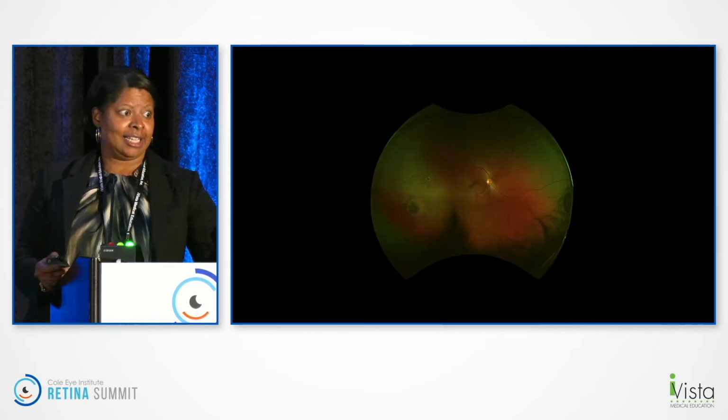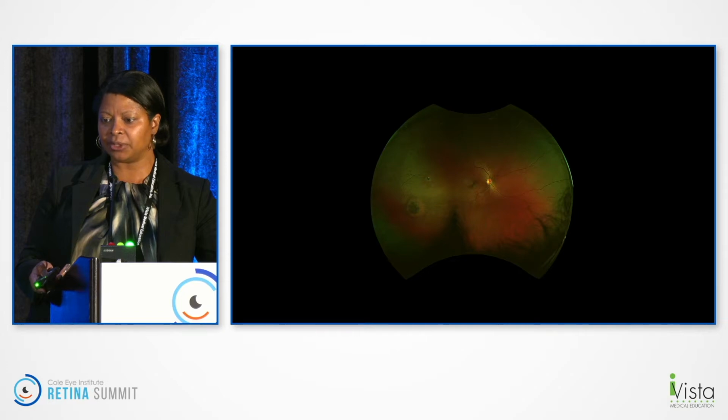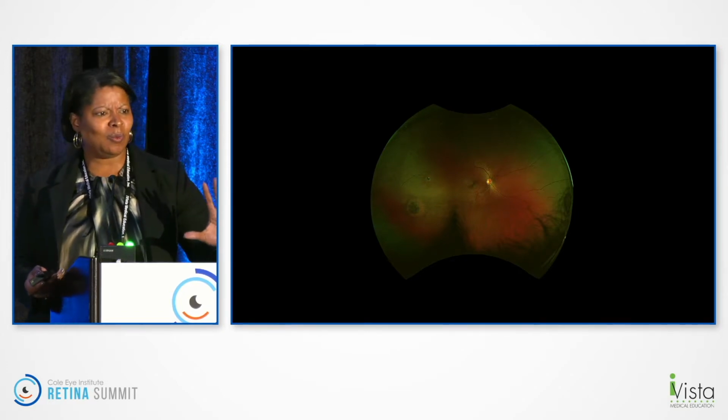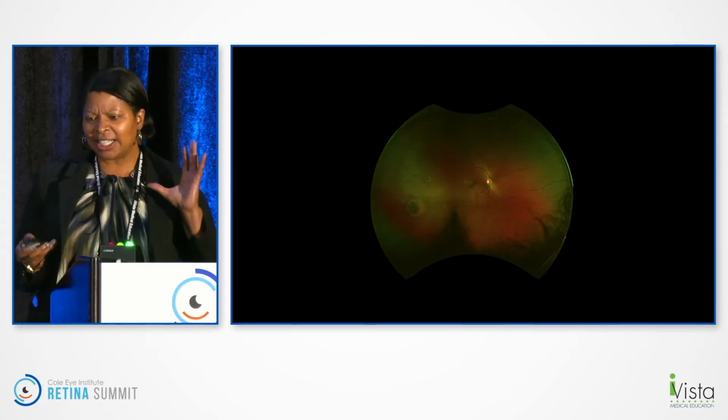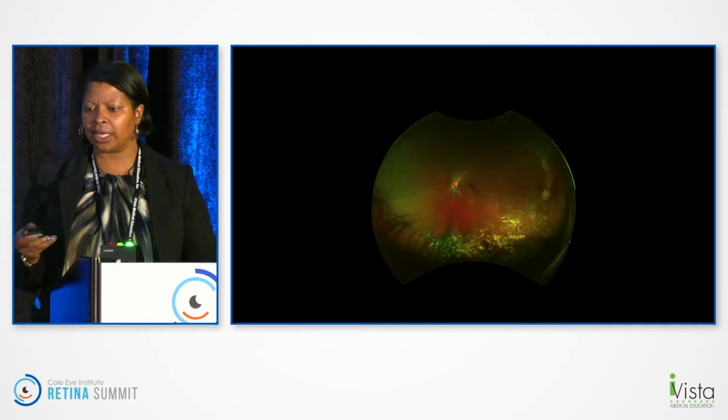We got a lot of things. This is an image of non-proliferative sickle retinopathy. This is a black sunburst lesion. So you got a little bit more lashes there, but you kind of get what you want to see in the disease. You're getting the periphery, so you get the gist of what's going on, even though you're not capturing maybe the whole thing.